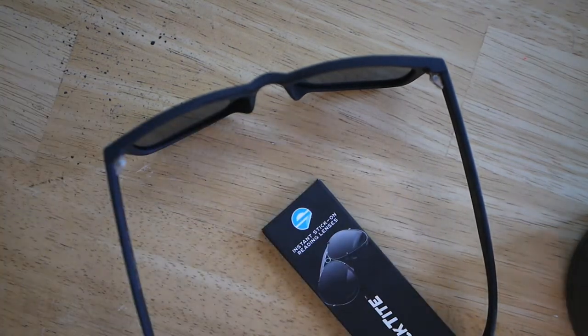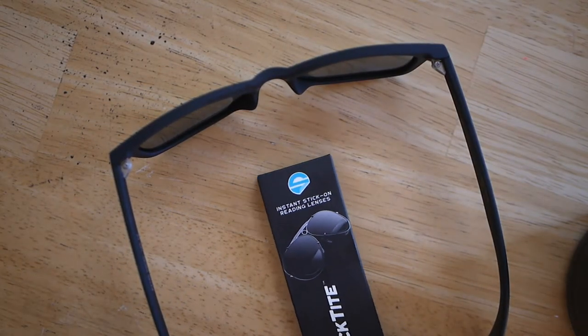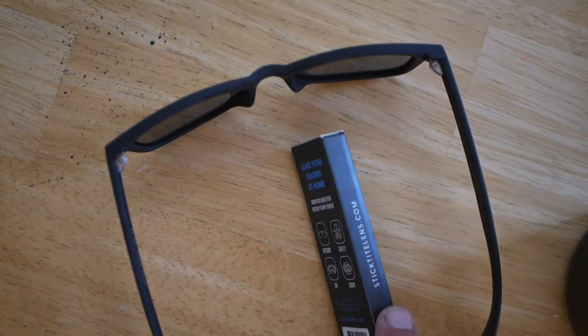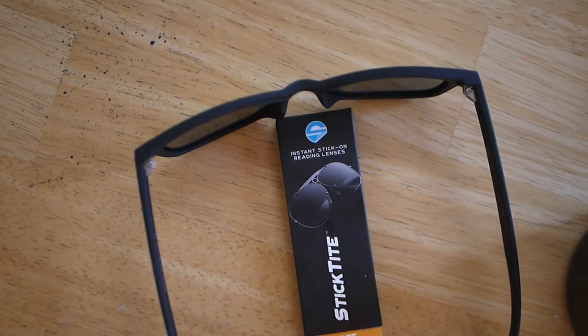I bought these on Amazon. This was a pack of three sunglasses, polarized, cheap plastic ones because I have a tendency to break things and lose things, so I just want to get some cheap ones at first. These were, I think, three for $18. And this one was, I can't remember, maybe $10? I'll put a link to all this below.